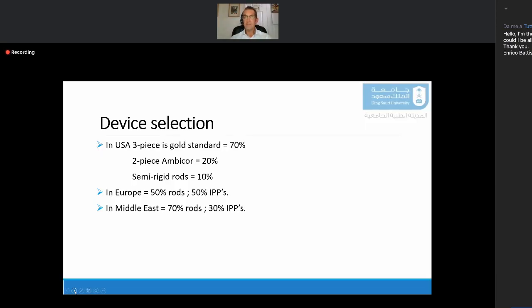Salah, back to you. So now, how to go from here when it comes to device selection, and these are the statistics that I got from my review. I understand the three-piece penile prosthesis is the gold standard among 70% of the people who go for implantation in the USA, 20% for the two pieces, and only 10% for the semi-rigid rods. So it's not very popular in North America. When it comes to Europe, it's 50% between the inflatable and the malleable. As I said before, when it comes to the Middle East, most of the implants go to the malleable prosthesis, and 30% go to the inflatable prosthesis.